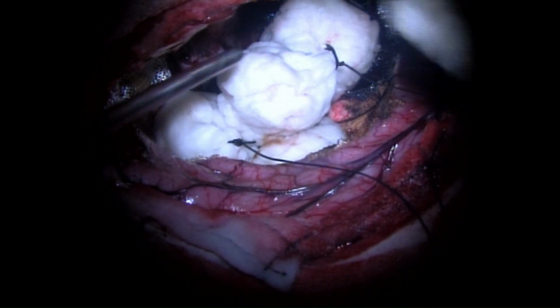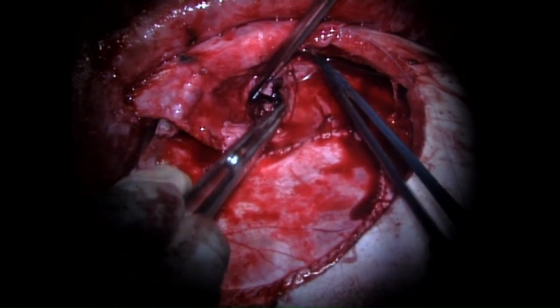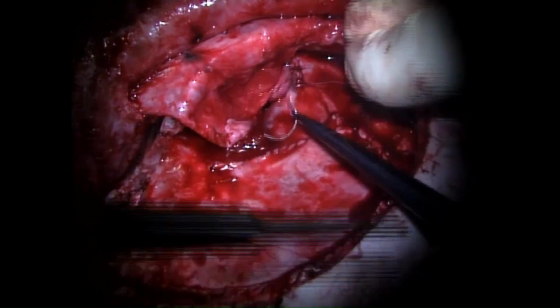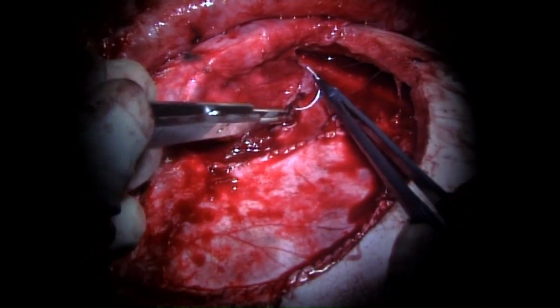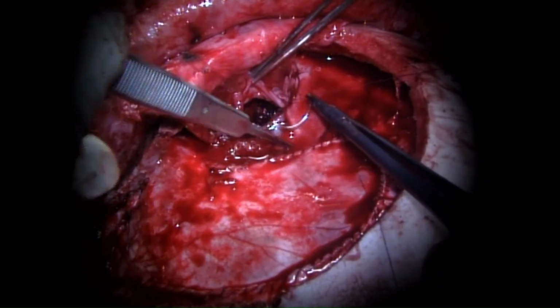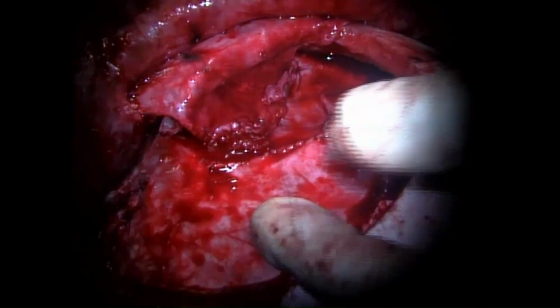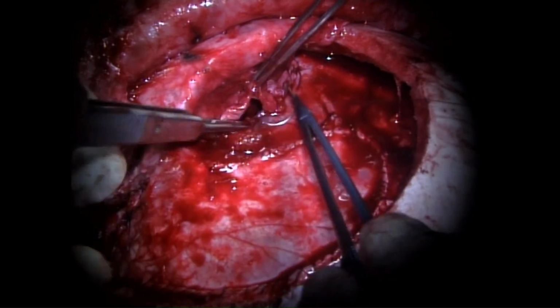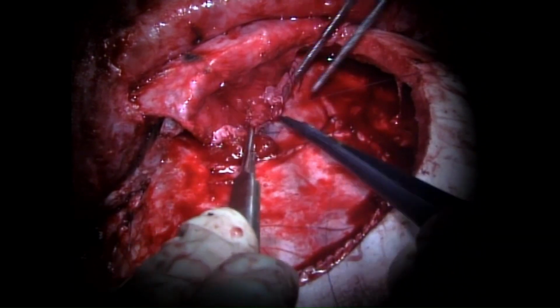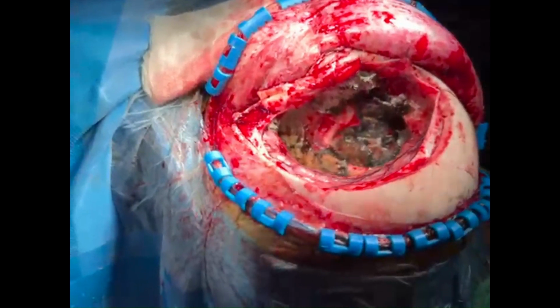The dura was closed watertight, and then supplemented with a pedicled pericranial graft in an area which was tenuous and needed a repair. The epidural space was obliterated by the placement of tack-up sutures.